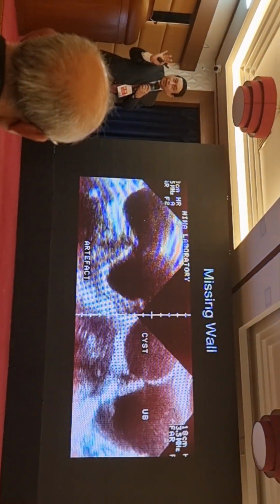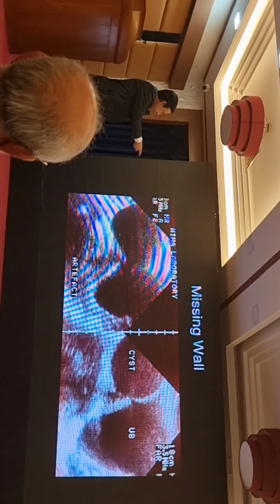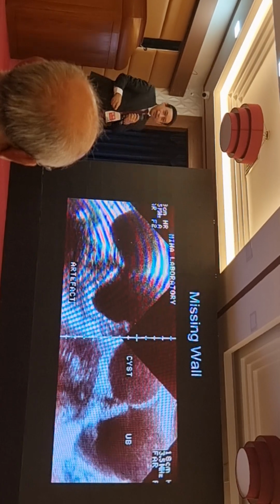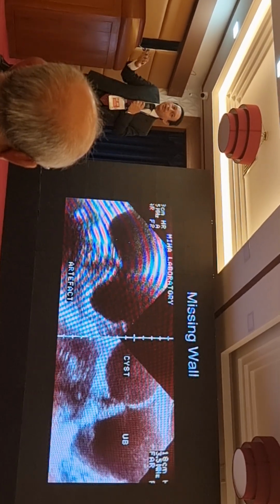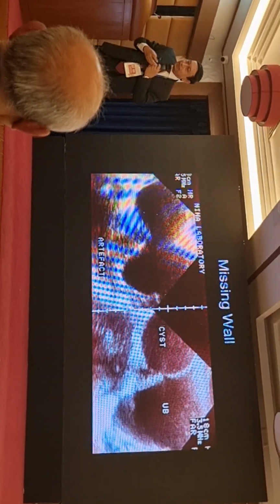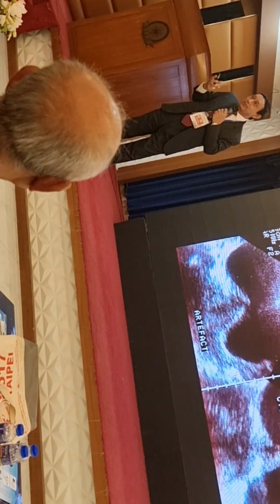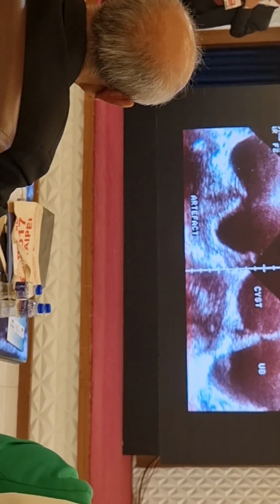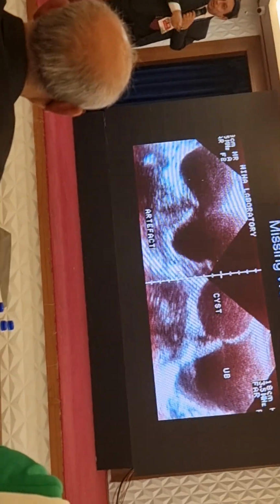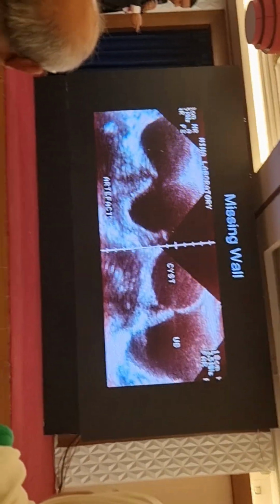And that is not very uncommon. You will get it in many patients. You see, there is another patient. So one is urinary bladder, another one is cyst. And in our daily practice, many of our gynecologists and obstetricians used to complain, "So big a cyst, but you didn't find it." But after a person, I am getting a 7, 8 or 10 centimeter size cyst. So I think many times this happens.